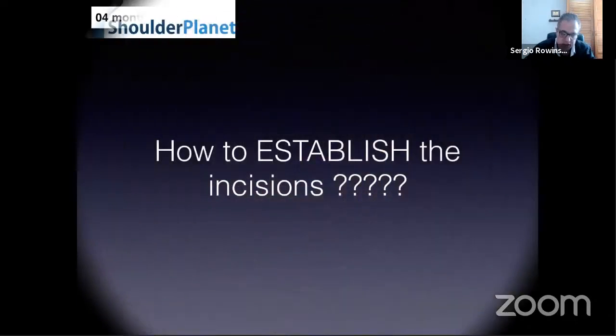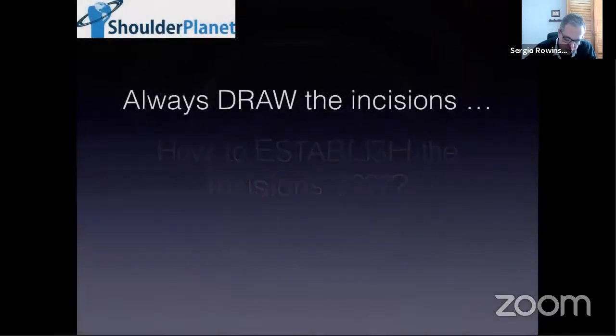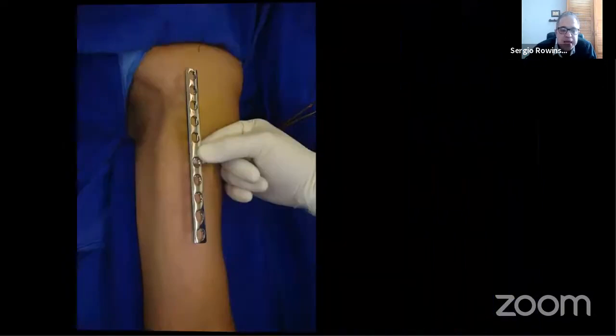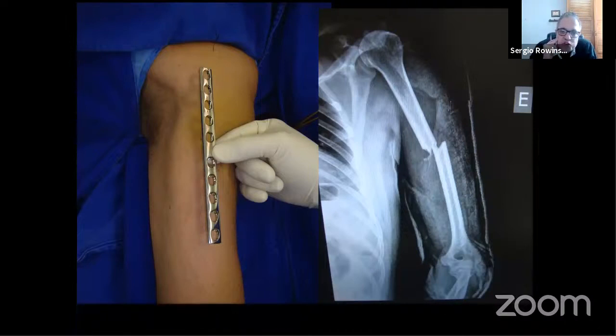So she rides a bike, she doesn't remember she has a plate. How do I establish my incisions to become very small? I'm going to show you many cases. I always draw the incisions, and let's understand how to draw them. In the very beginning of the surgery, under traction and little flexion of the elbow, you have to imagine that I am looking at the C-arm. It's much easier to understand it looking at the X-ray, but I am looking at the C-arm. Keep this in mind.